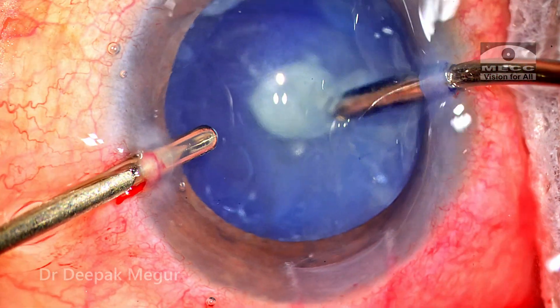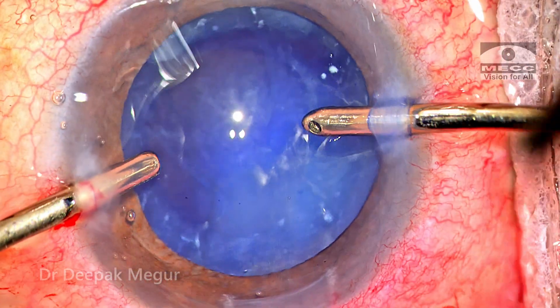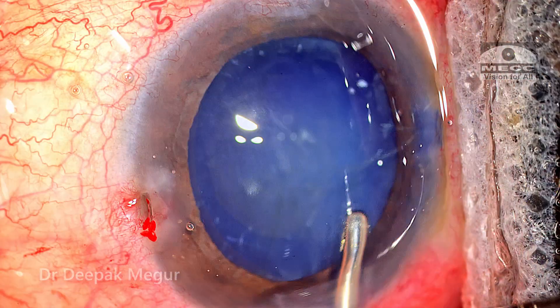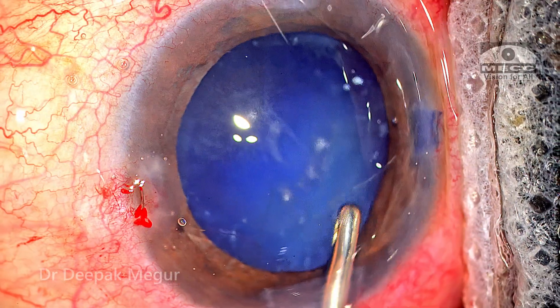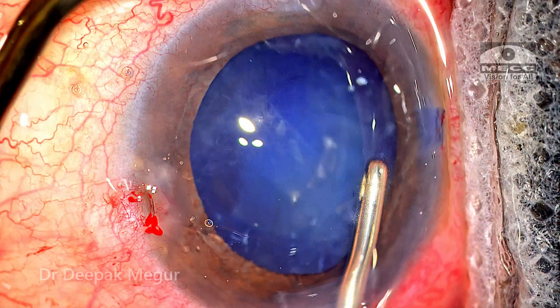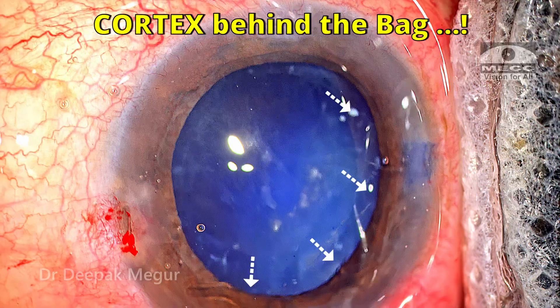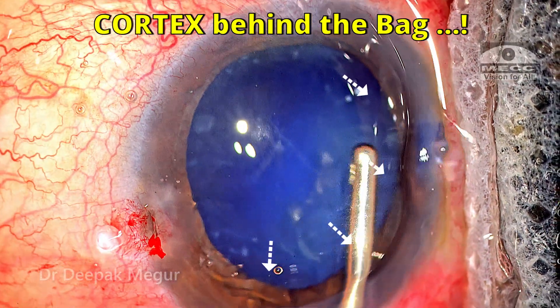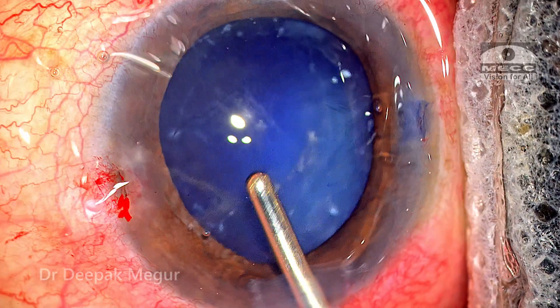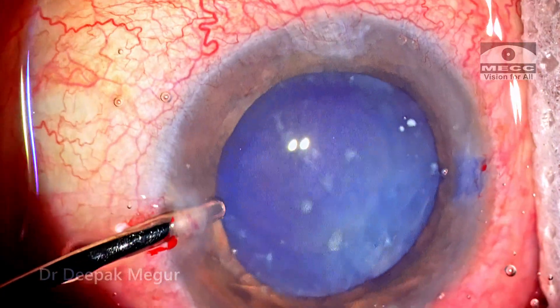This looks like a tiny endonucleus — it's just disappearing under the fornices of the bag. I depress the main wound and again this looks like the mini endonucleus and it just gets flushed out. There's a bigger problem here: although there's not significant cortex within the bag, there is significant cortex that has percolated behind the posterior capsule into the Berger's space. This is a common situation found in lens particle glaucomas.